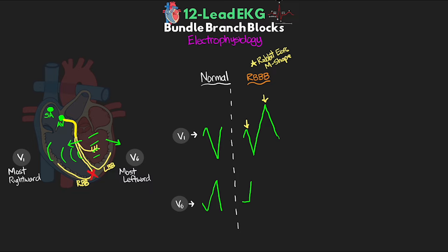Looking at V6, with electrical activity moving away we see a negative S deflection. With right bundle branch block, it's normal to have a T wave going in the opposite direction of the terminal wave of the QRS complex — this is T wave discordance, which is normal in bundle branch blocks. In V1, since the terminal wave is positive, we see a negatively deflected T wave; in V6, since the terminal wave is negative, we see a positive T wave deflection. Importantly, right bundle branch block actually limits our ability to diagnose right ventricular hypertrophy, which will be discussed in a future lesson.